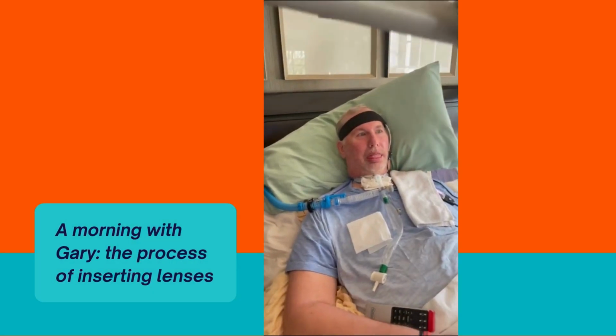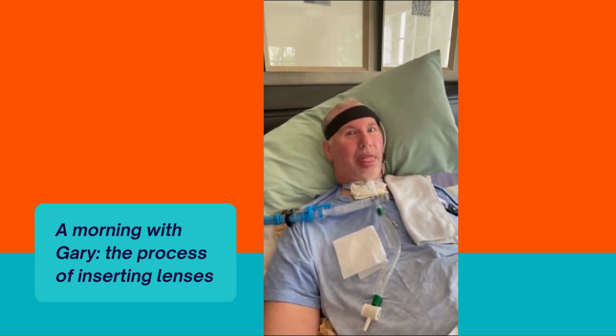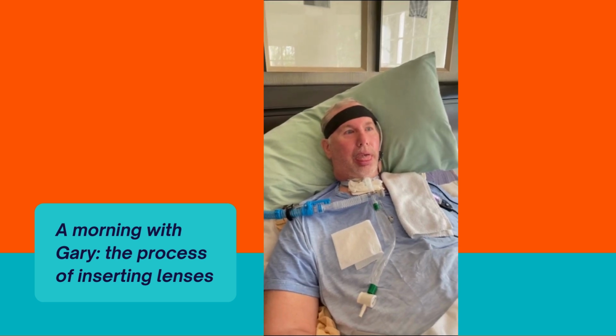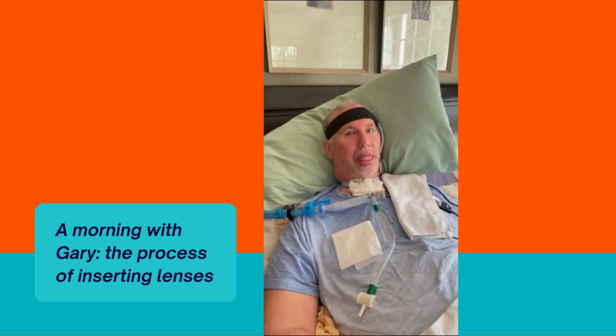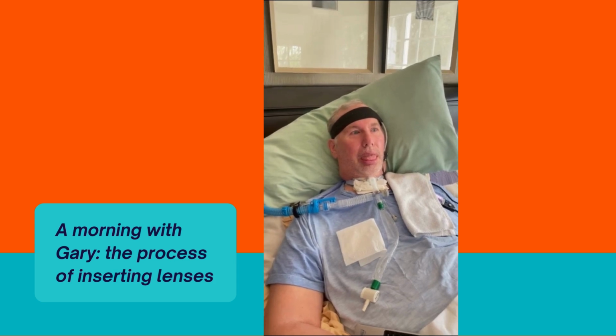Okay, we're gonna put in contacts for Gary this morning. So there's Gary. He's been sleeping last night, and we've already cleaned his eyes this morning. Just cleaned him out with some regular solution to get him clean. So, hey, Gary. He's also wearing a beeper on the side. That's how he signals and things like that. If you're wondering what's on his head, but anyway.